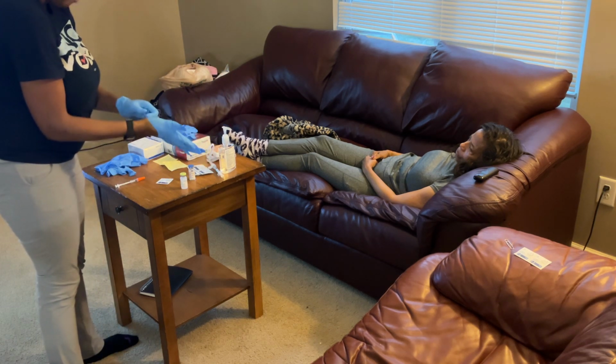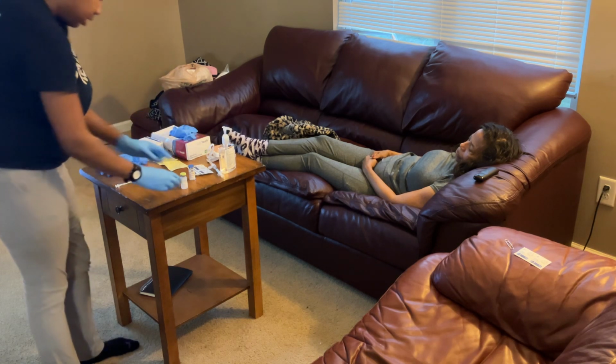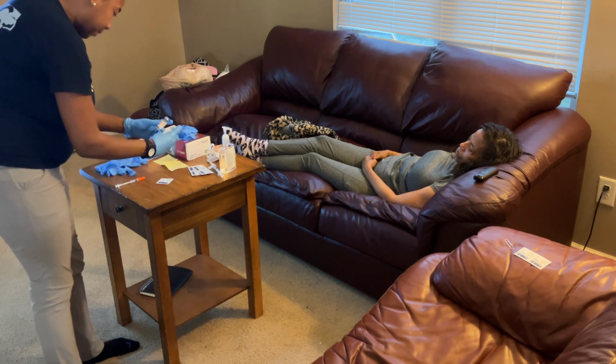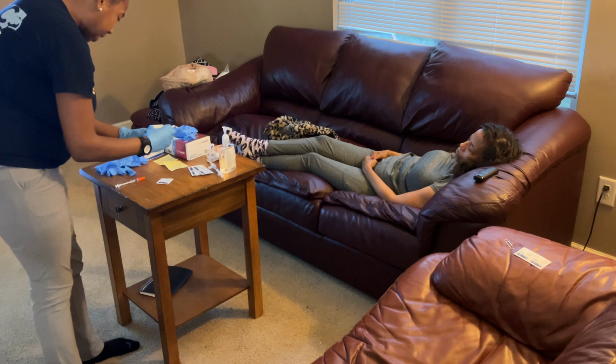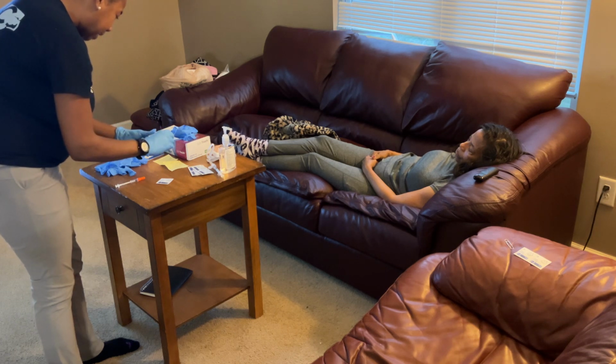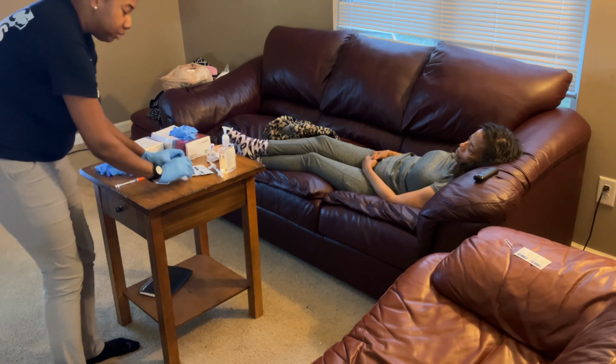And I'm going to check my MAR twice against the medication for the 7 rights of medication administration. So I'm going to be administering 5 units of regular insulin and 5 units of NPH to Charlene Allen subcutaneously, to be documented later. The time is now, and this is for diabetes management to control glucose levels.